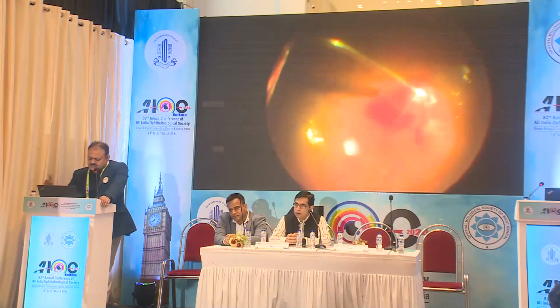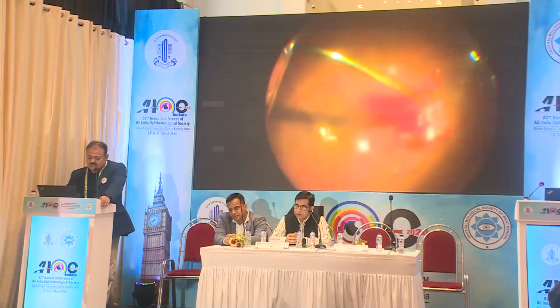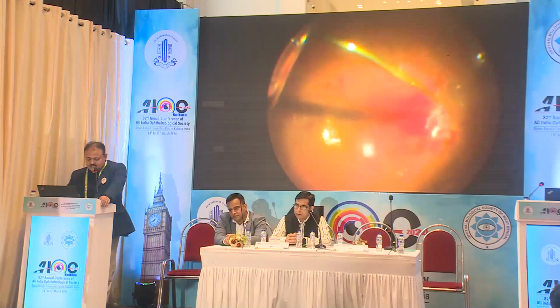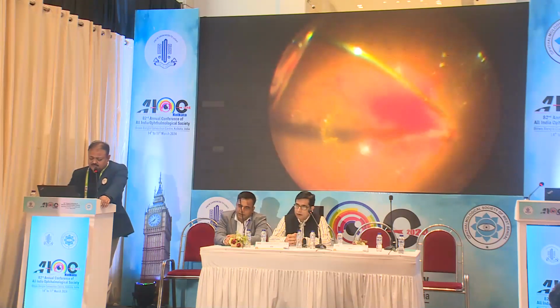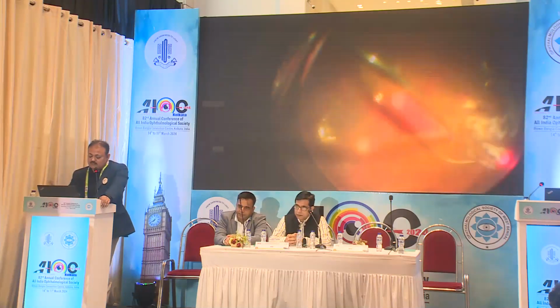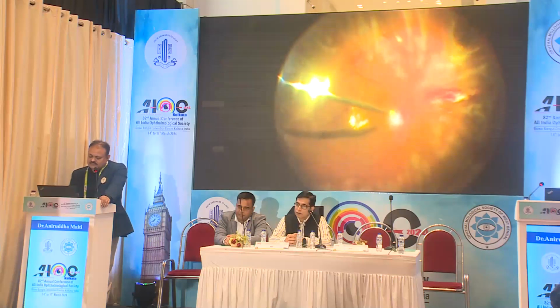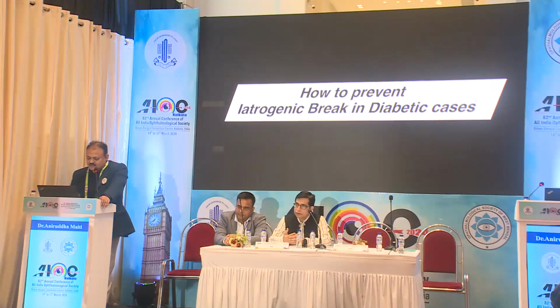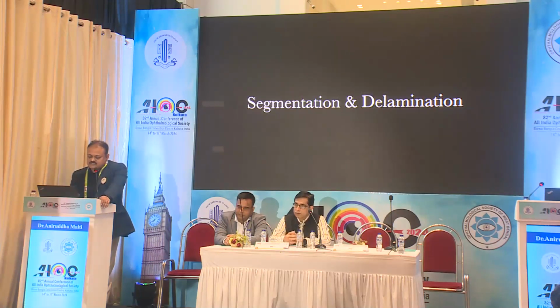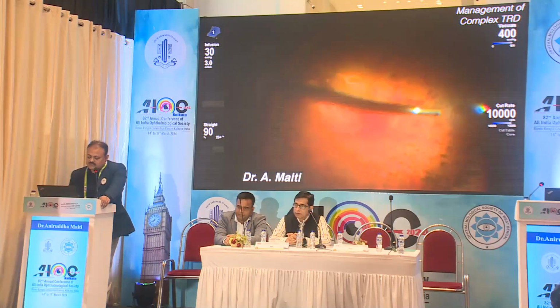Nowadays the use of forceps should be minimal because we have very good instrumentation and we can prevent this iatrogenic break. In order to remove this membrane from the nasal side, this break was created. This can be prevented by the bimanual technique. Now this is how it should be done, where we can prevent this iatrogenic complication.